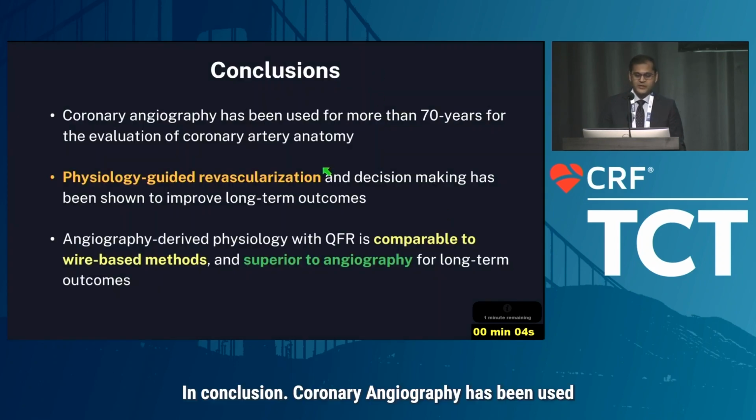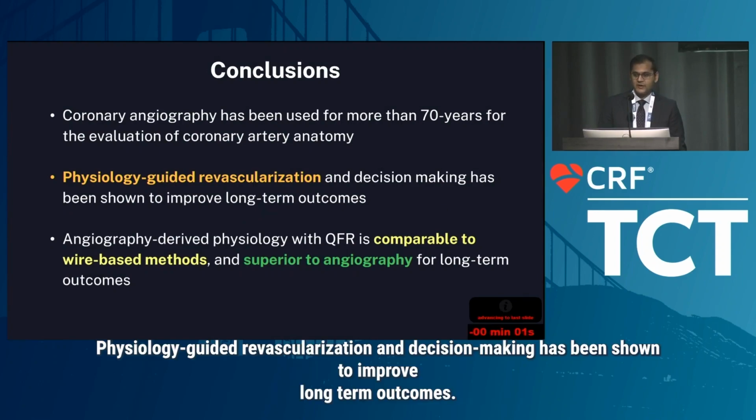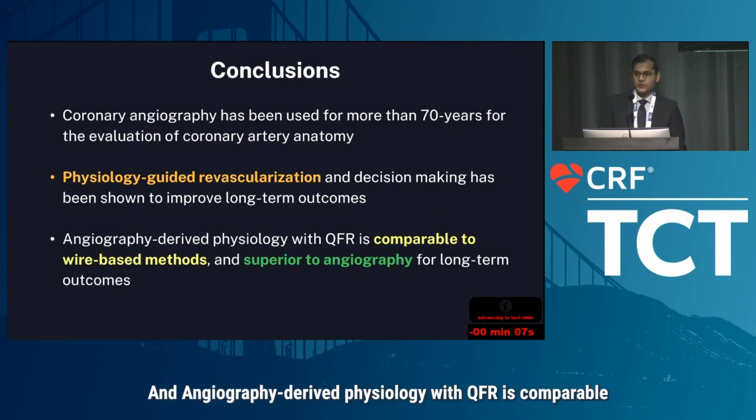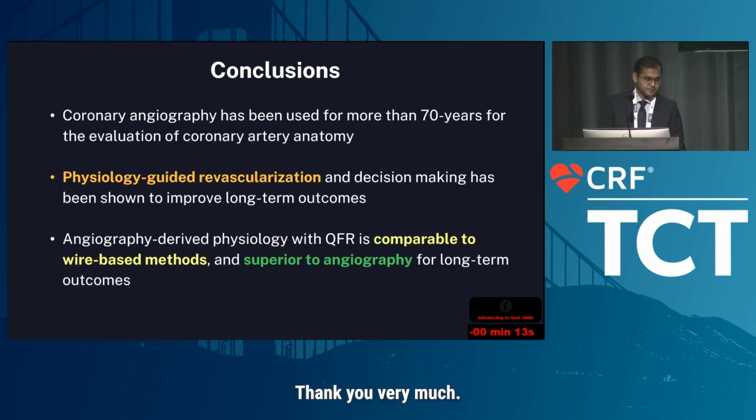In conclusion, coronary angiography has been used for more than 70 years for the evaluation of coronary anatomy. Physiology-guided revascularization and decision-making has been shown to improve long-term outcomes. And angiography-derived physiology with QFR is comparable to wire-based methods and superior to angiography for long-term outcomes.